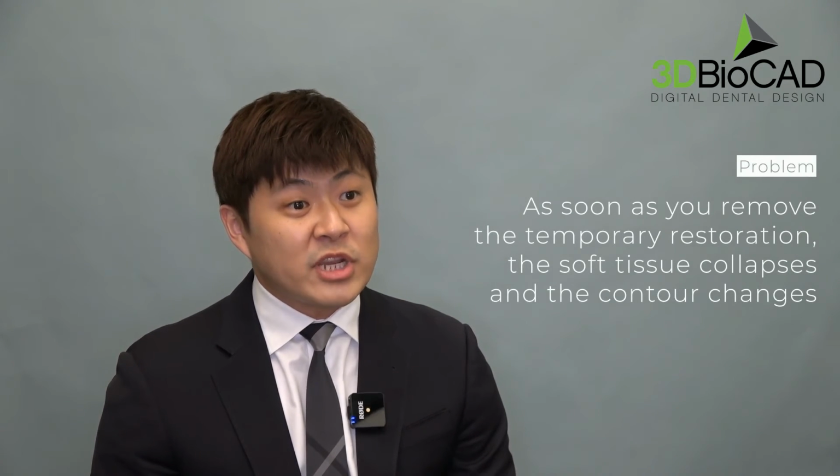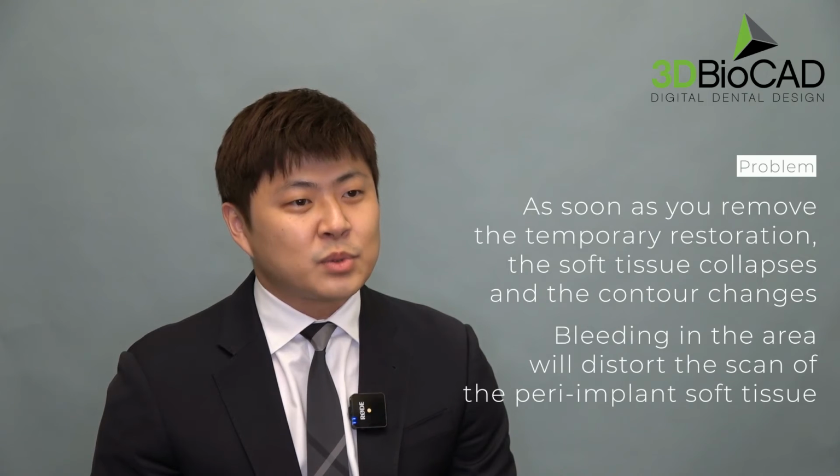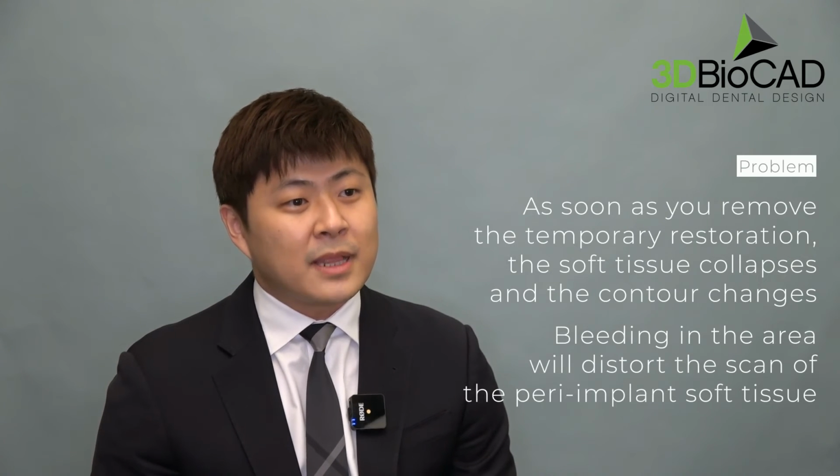So how do we transfer the emergence profile digitally? One way of doing this is to remove the temporary restoration and immediately scan the peri-implant soft tissue using an intraoral scanner. But the problem with this is as soon as you remove the temporary restoration, the soft tissue collapses and the contour changes. And you may even get bleeding in the area, which will distort the scan of the peri-implant soft tissue.